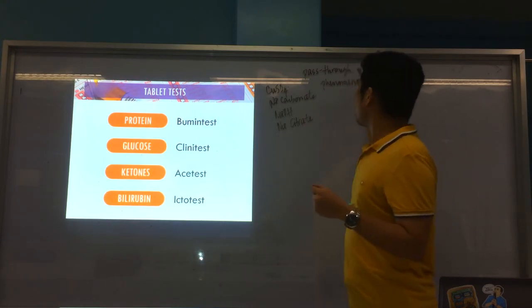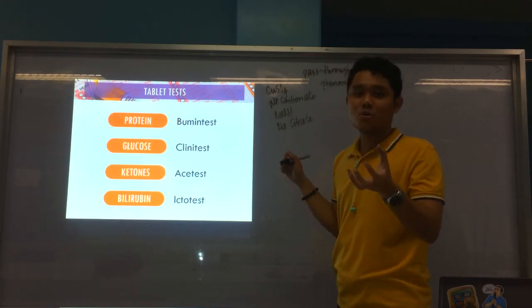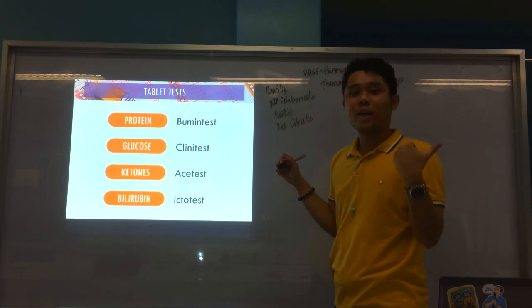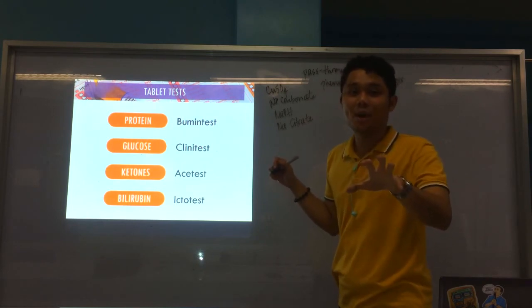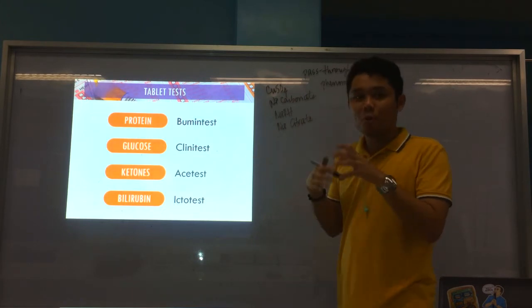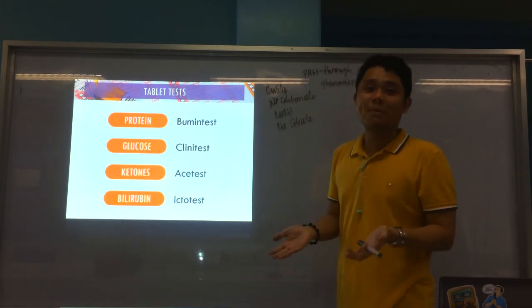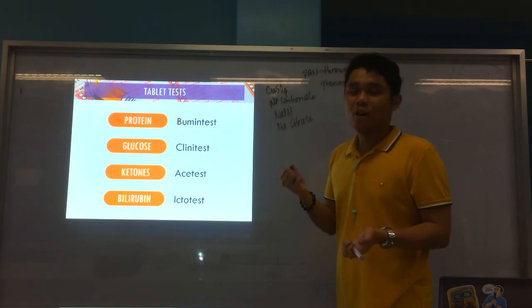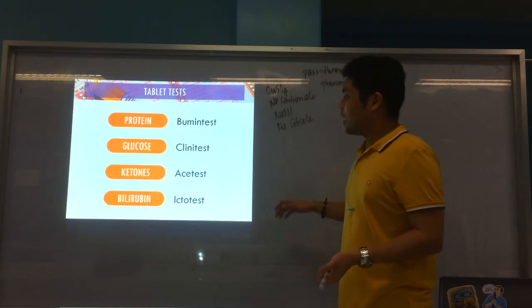With 2 drops, since there is little glucose, only a little copper sulfate is converted, so only a little precipitate is created, because little glucose is available. Whereas with 5 drops, more precipitate is created and the precipitate reaction lasts longer. Okay, that's for the Clinitest.